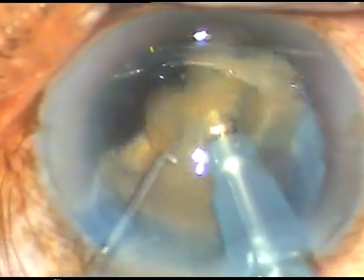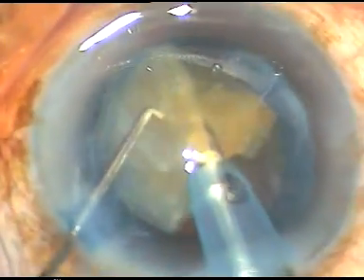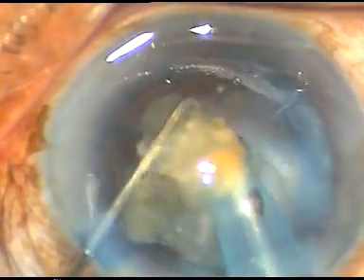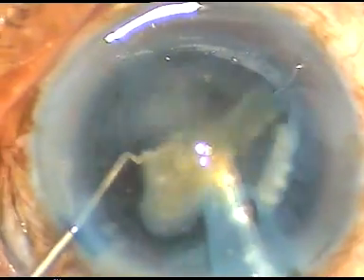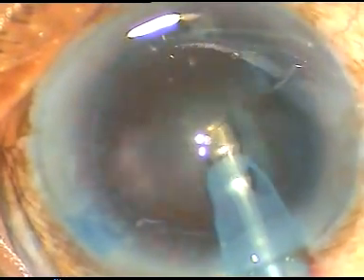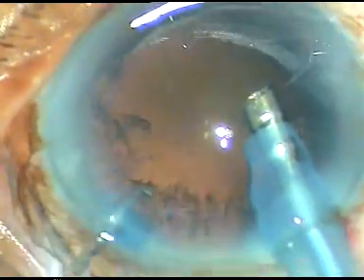And at this stage you can see that there is no support of epinucleus in this case, and it's a free floating cataract, and it has been managed quite well.